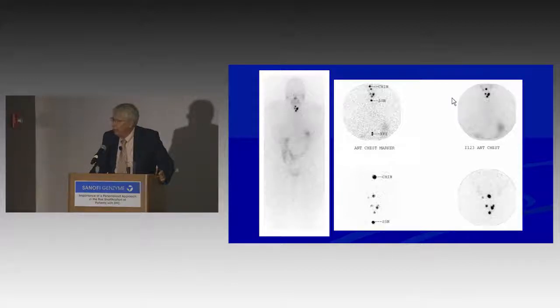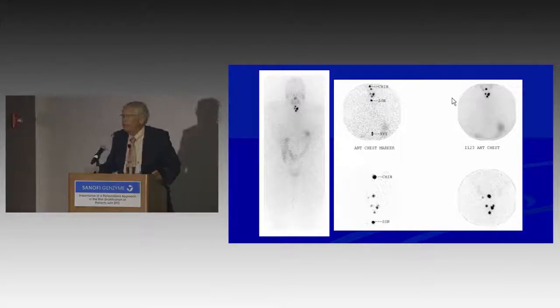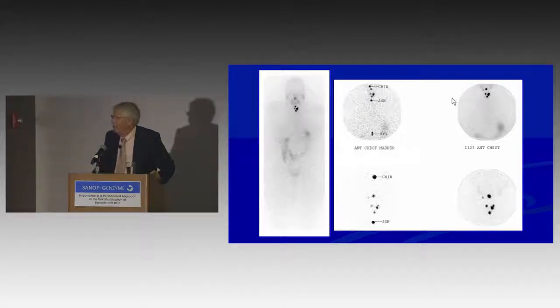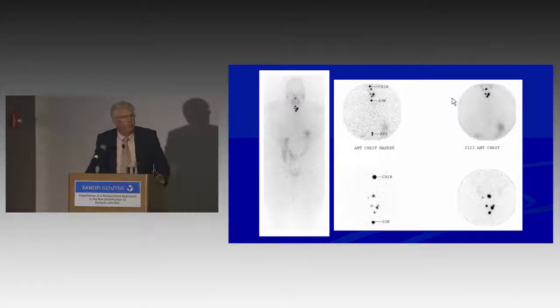1, 2, 3, 4, one of them's a little bit higher. Little concerning that that's not in the thyroid bed. I'm not sure what this means. The interpretation comes out, you know how they read. It says interpretation: multiple findings in the thyroid bed, most consistent with normal residual thyroid tissue. Number 2, no evidence of distant metastasis.